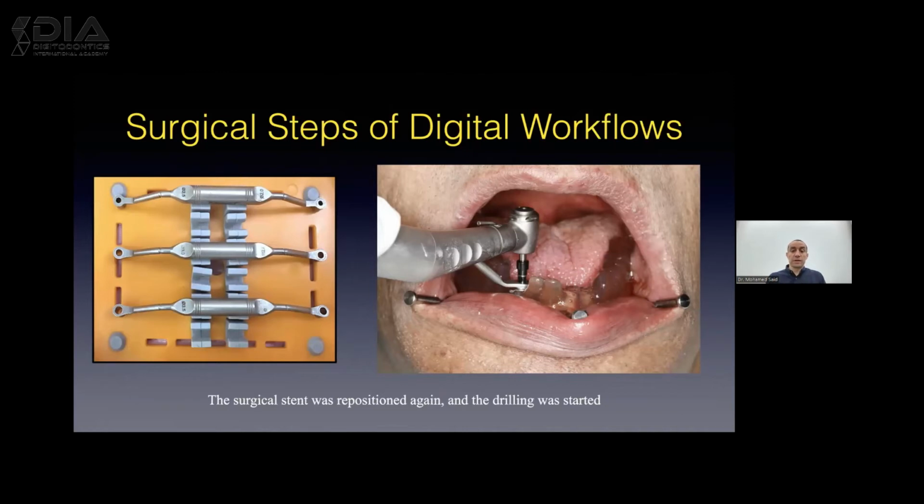of the implant position. We always have this kind of keys, and for each key there is a corresponding drill. So depending on the diameter of the drills that you are using, you are going to use the specific key for this specific drill. So as we can see here, for this diameter, the key is placed over the sleeve, as you can see here. This is how the key is going to be placed. And then from the key, you are going to drill through the bone and the tissue until you reach the exact length that you are aiming for.